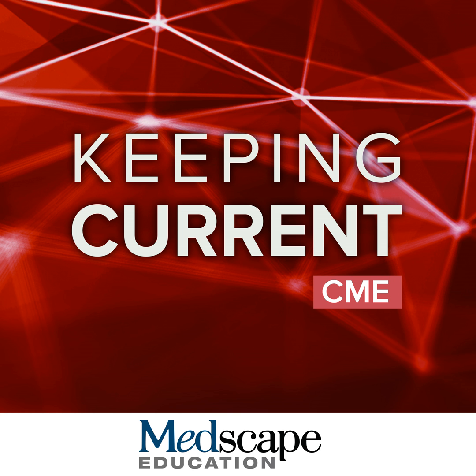And then another elegant study here shows how all of the mapping techniques can be put together, T2 mapping, late gadolinium enhancement, as well as T1 and ECV, to help characterize and distinguish patients with acute infarction, chronic infarction, as well as suspected acute coronary syndrome. The most useful in actual practice is T2 mapping to be able to distinguish edema versus non-edema. The edema is a marker of acuity, so acute infarctions will show elevated T2. Acute myocarditis, for example, will also show elevated T2.